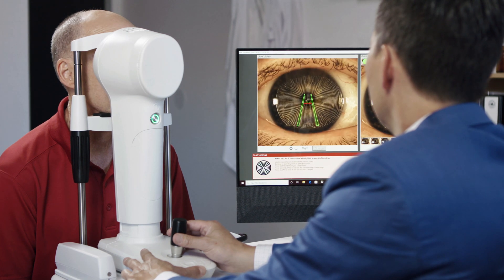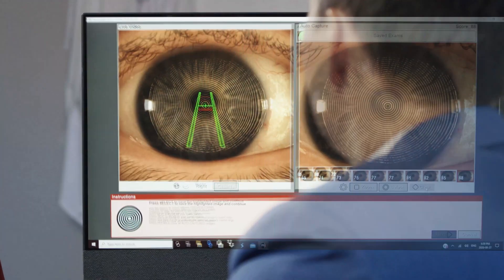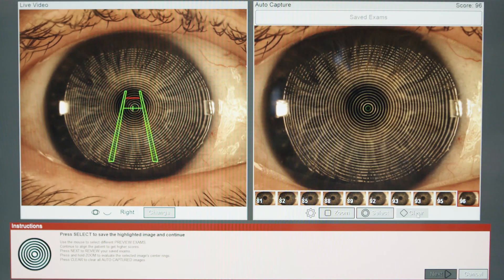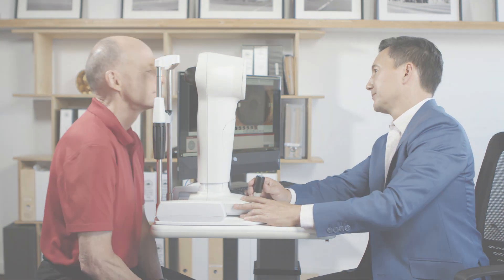Any capture that has a quality placidal reflection with an absence of ring jam and is above 90 percent is considered an acceptable capture.